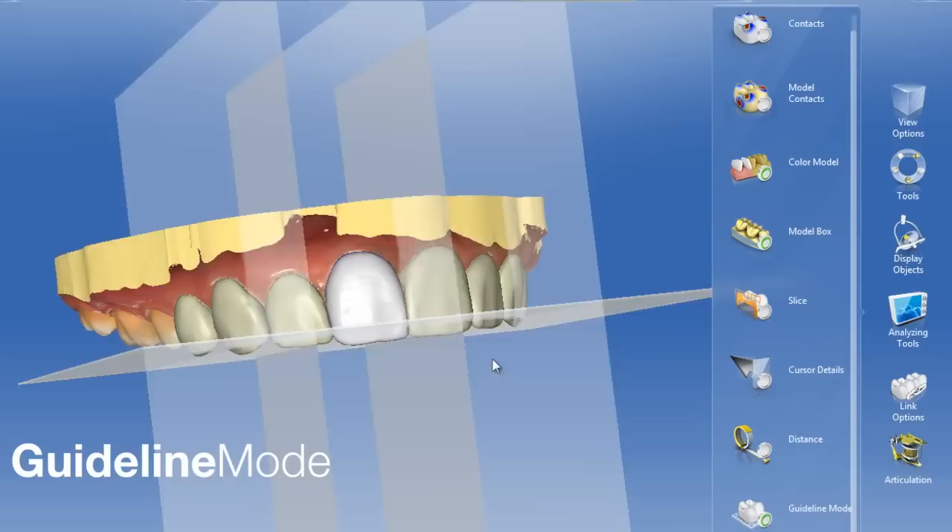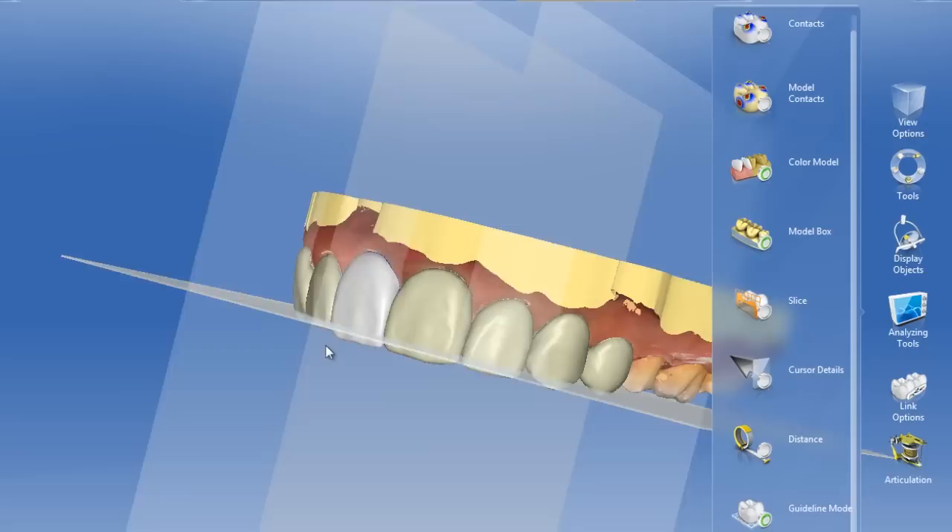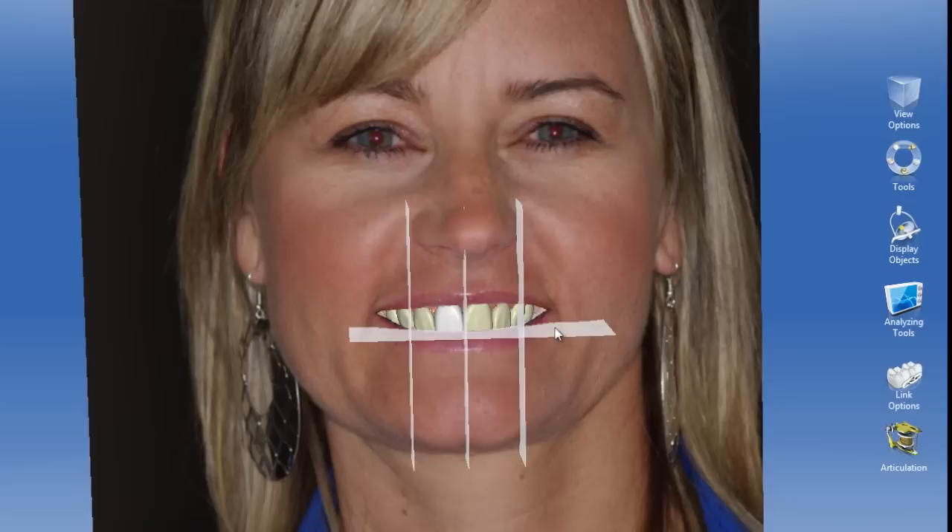There's a nice guideline mode that allows us to see horizontal and vertical references better. That way we can look at the midline to make sure the left and right seem symmetrical. We can also take that to the face so we can see how those angles — the horizontal and the vertical — will line up with the face. It's a very nice feature to get good parallelism with the pupils.